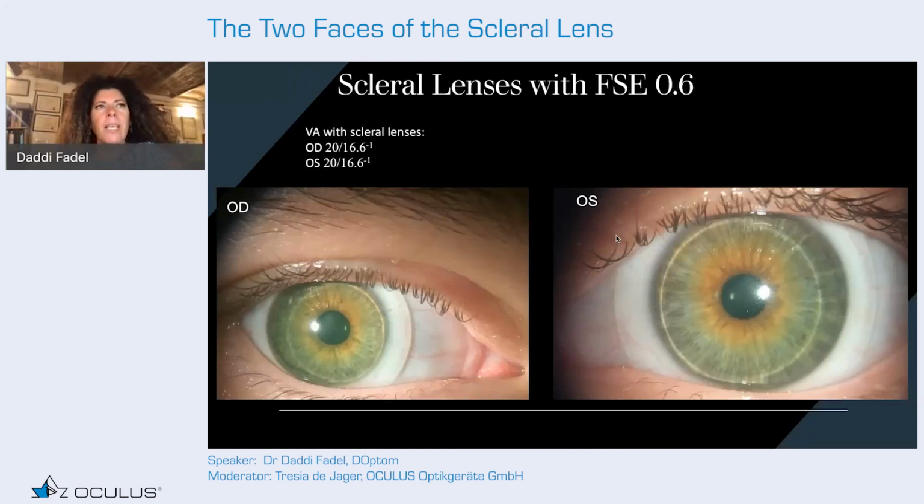Well, specialty cases need specialty lenses, and the technology is available for both lenses. It depends on the practice that you are building and you have built. My practice is specialty lens, and I see much more specialty cases. So I must say maybe 90% of my patients are specialty cases.